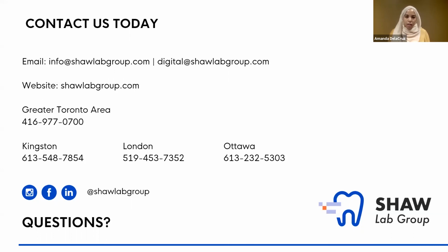Also, we work with our zirconia to have its maximum strength. We like to have 0.6 millimeters in zirconia. That doesn't include the cement. It doesn't include occlusal clearance. So I would say 0.8, 0.9 millimeters is the minimum if you want to go with the zirconia restoration and you don't want to reduce the opposing or anything.